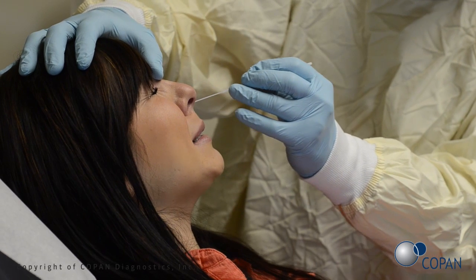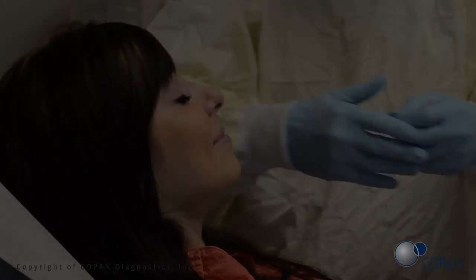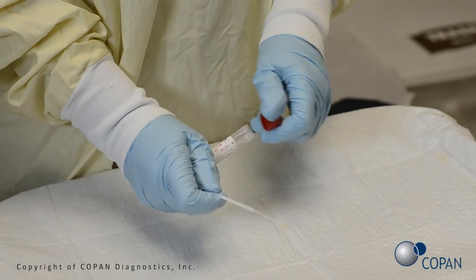Rotate the swab several times against the nasal wall. Gently remove the swab and perform the test according to the manufacturer's instructions.